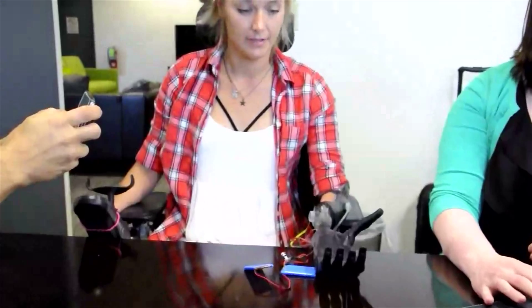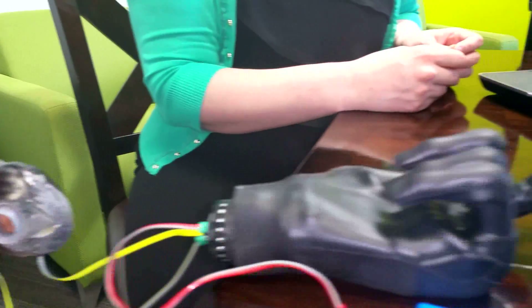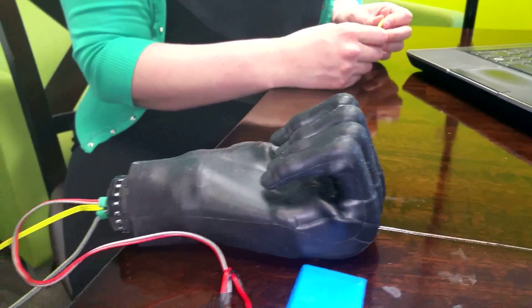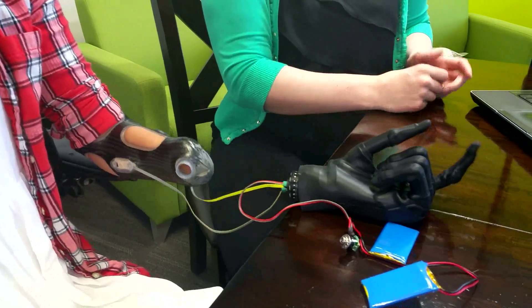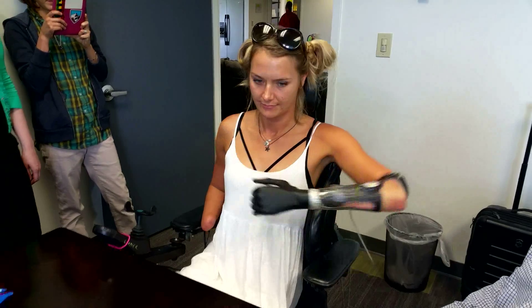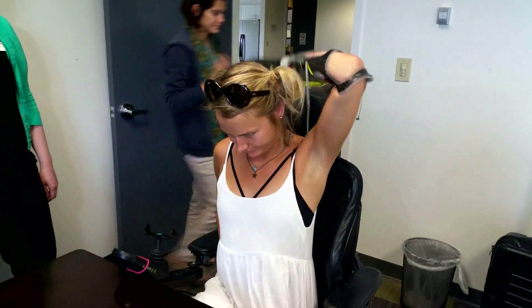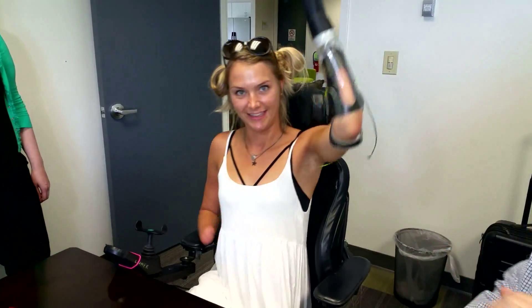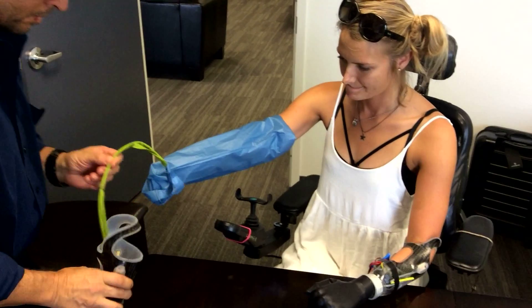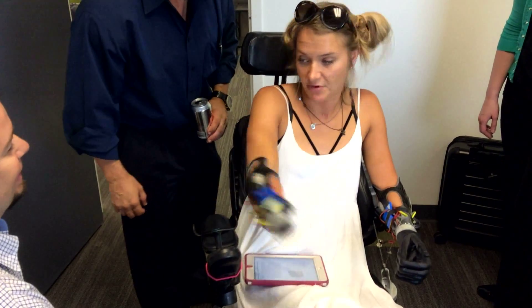Electrodes in the right spot? Yep, they're super easy to trigger. Maybe — scratch my back. Oh yeah, so good. And it feels solid when it's up here and bent back, it's not going to fall off you, right? Nope. Not even close. I mean, it's comfortable.